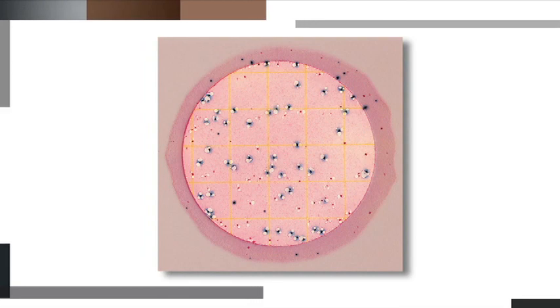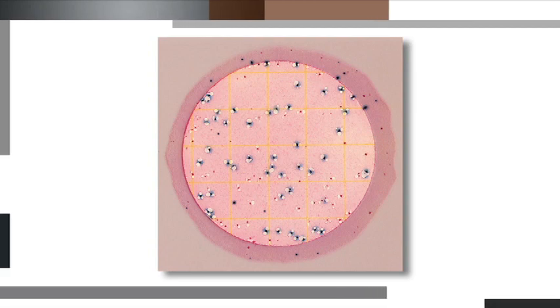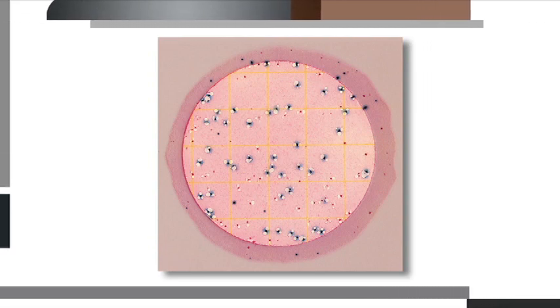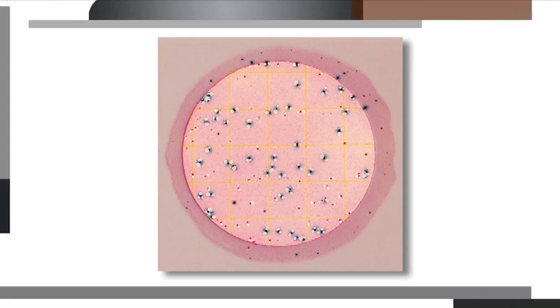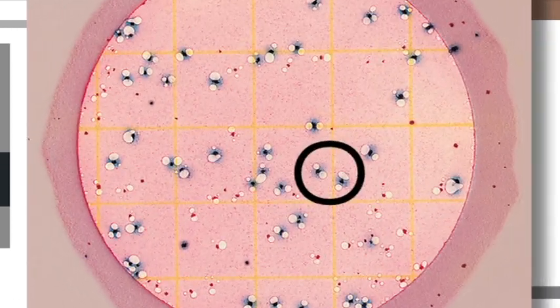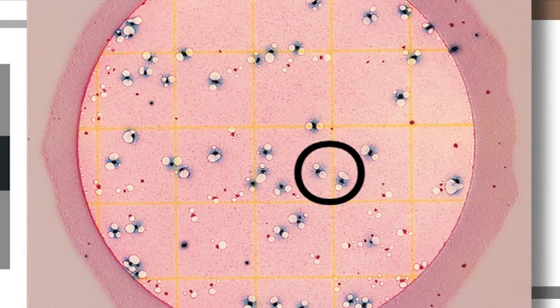In addition to the components of the 3M PetriFilm coliform count plate, the 3M PetriFilm E. coli coliform count plate contains a glucuronidase indicator dye, which forms a blue precipitate around the E. coli colonies. The top film traps gas produced by E. coli. Count the blue colonies associated with gas bubbles as E. coli.